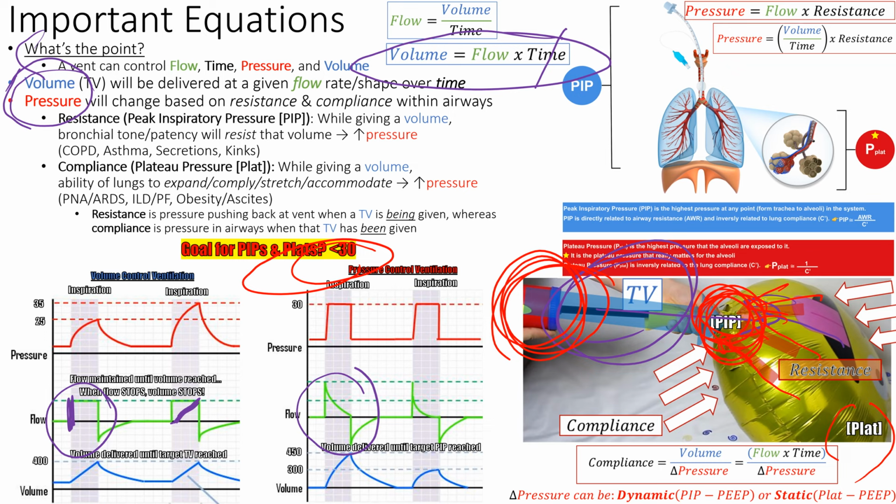It could be two things, right? It could be a really, really tight neck right here, right? So the neck of the balloon, or the bronchus is bronchospasmed, or there's food in the airway, or maybe a patient already vented and they're biting on the tube. That's making it really difficult to get this air into the chest, right?